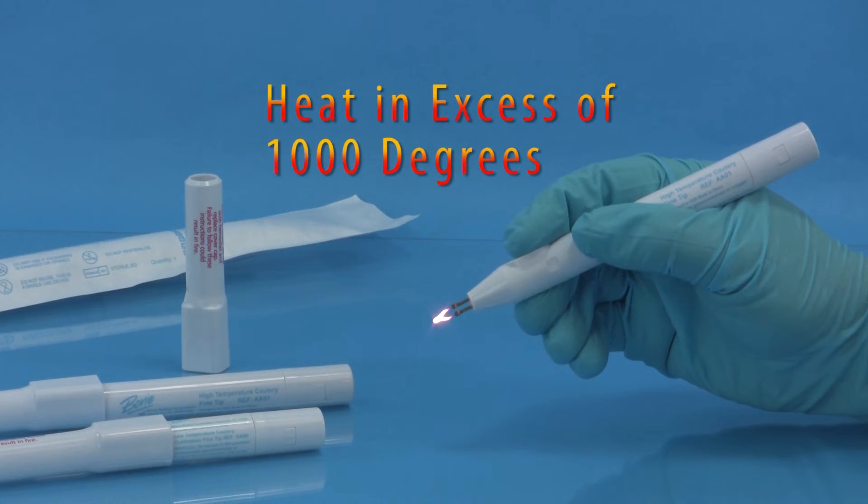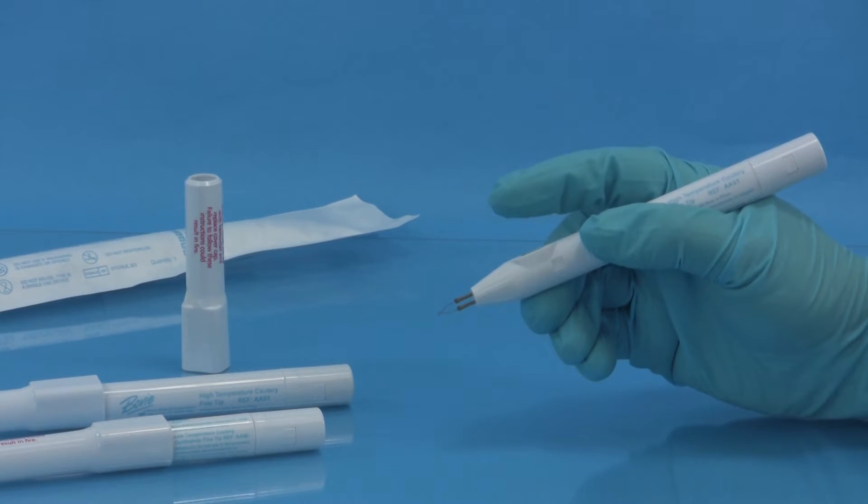Cauteries produce heat in excess of 1000 degrees Fahrenheit, which can cause burns or fire from misuse.